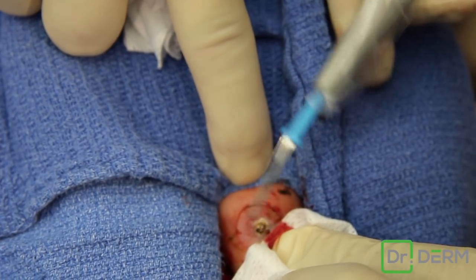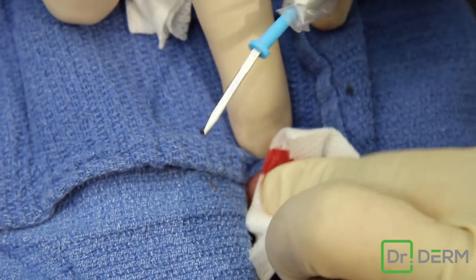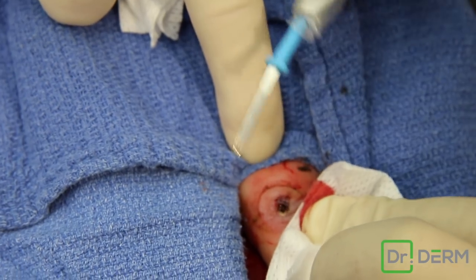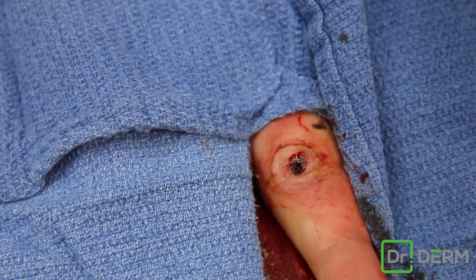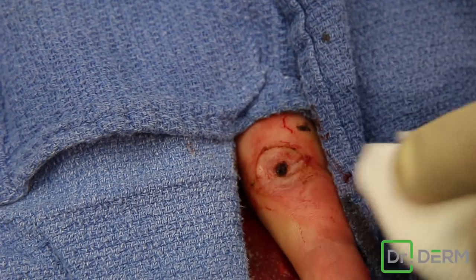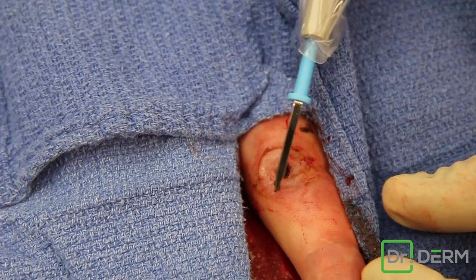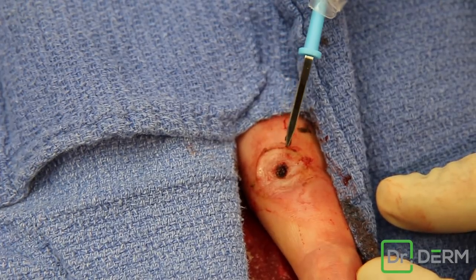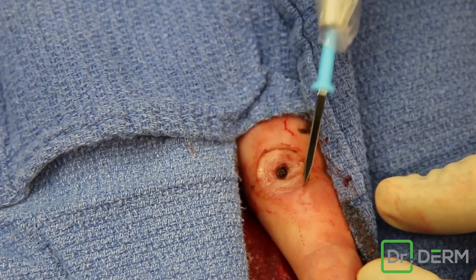Are you cauterizing it? Yes, ma'am. That's it. Isn't that crazy? That's really... that's all? That's it. This cautery does two things — it stops the oozing, but it also keeps it from coming back. And look at all that from just that pyogenic granuloma sitting there — just gets all that fluid and swelling and liquid. It's kind of macerated around the outside.